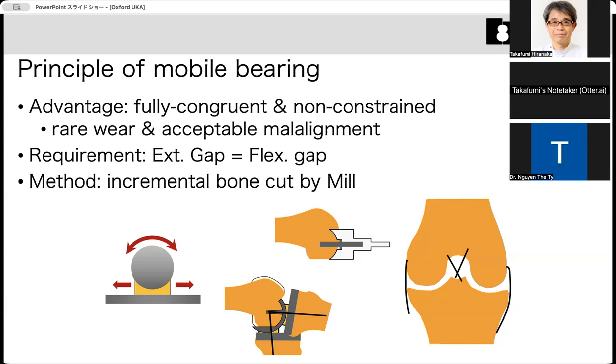For example, so evaluate flexion gap and extension gap precisely. So cut the distal femur in the same thickness as this difference between flexion and extension gaps.